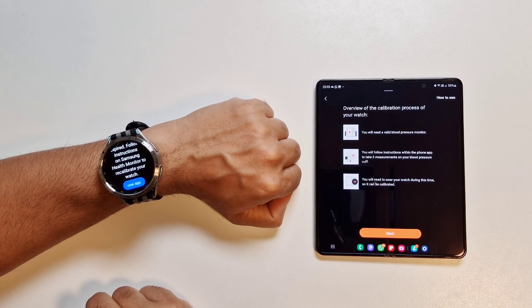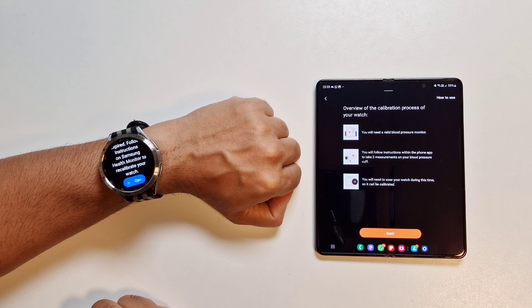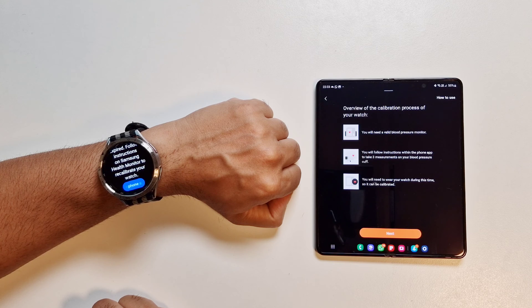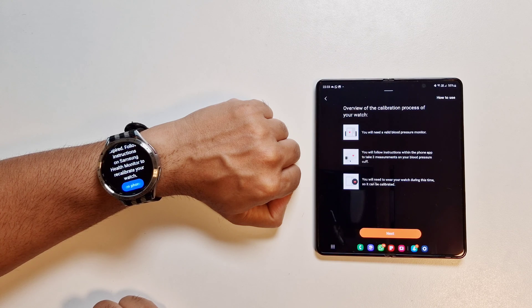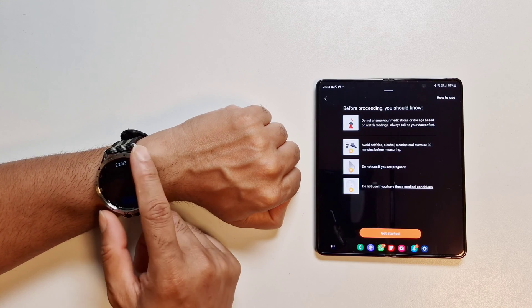Once you click on that, it gives you an overview of the calibration process. You'll need the medical blood pressure monitor with the upper arm cuff. You'll follow instructions within the phone app to take three measurements on your blood pressure cuff. You'll need to wear your watch during this time so it can be calibrated. With calibration it's recommended to take three readings, which you enter into your phone, and then the watch calibrates with the medical device.